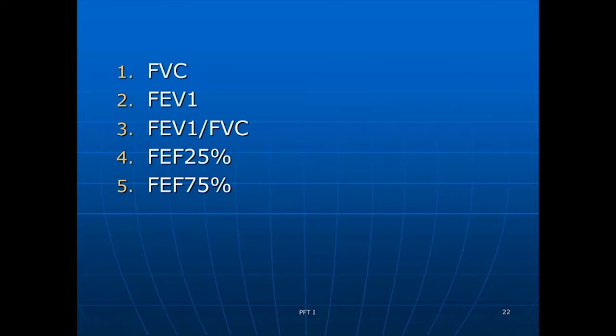So that's going to be a diagnostic, to say, well, the FEV1 in relationship to the forced vital capacity is 60%, so that's an indication that there's some type of disease process going on in the lungs. So these three things, the forced vital capacity, the forced expiratory volume, and the relationship between the two, look at volumes. So we're assessing volumes in the first three.